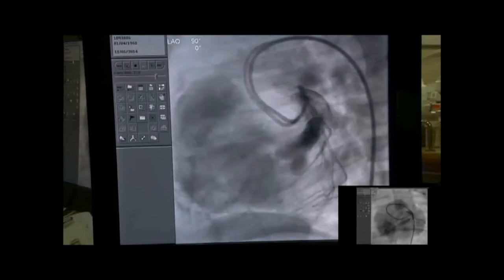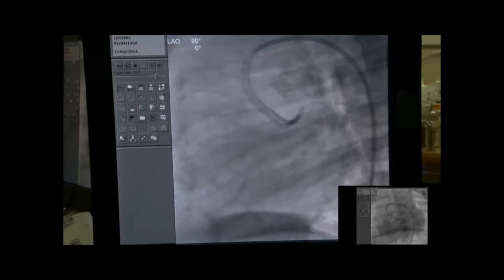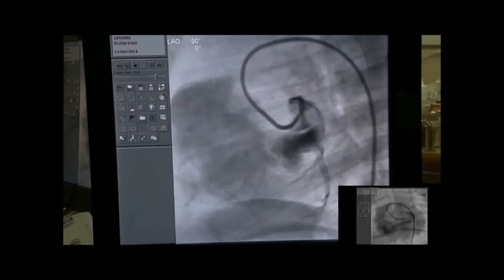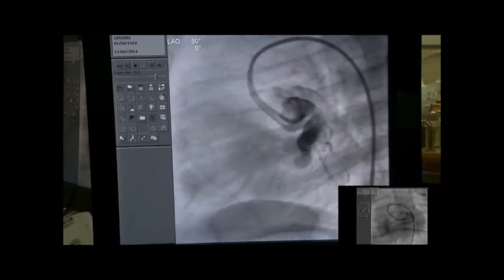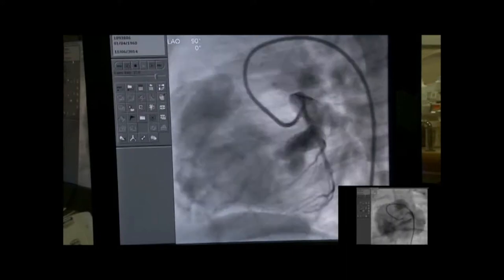We're now trying to show you the lateral projection as well. We see two large branches — circumflex, and probably the LAD, which is slightly distorted — and then the left coronary artery fistula.